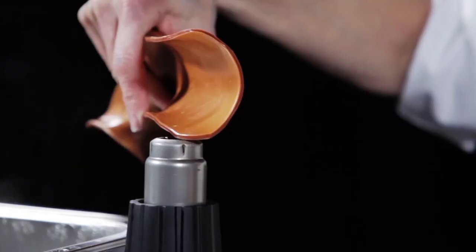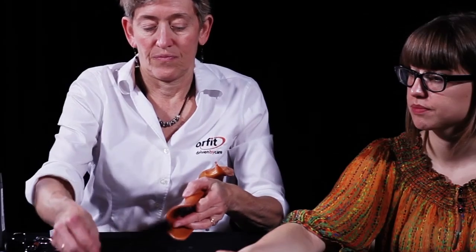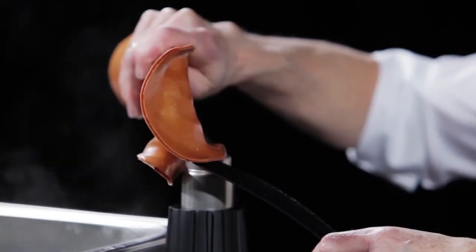Heat each spot with a heat gun briefly. Make sure not to overheat the material as it will lose its shape. Firmly press the Velcro loop strap into the heated thermoplastic. Repeat for the additional straps.